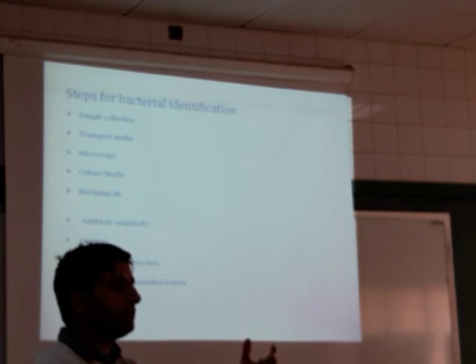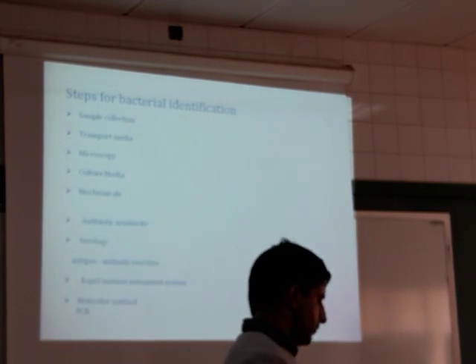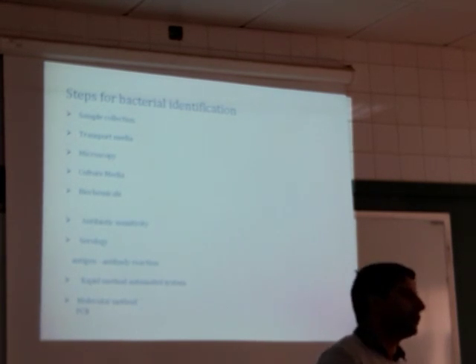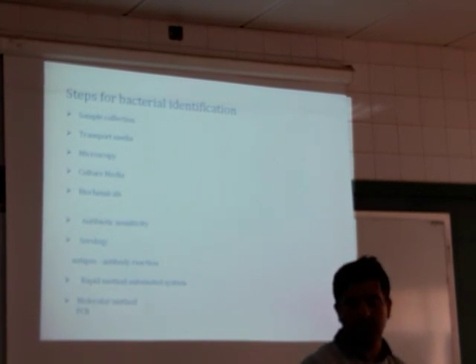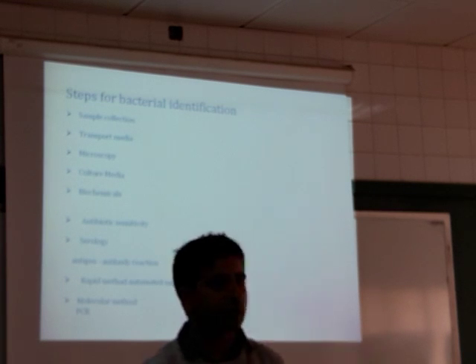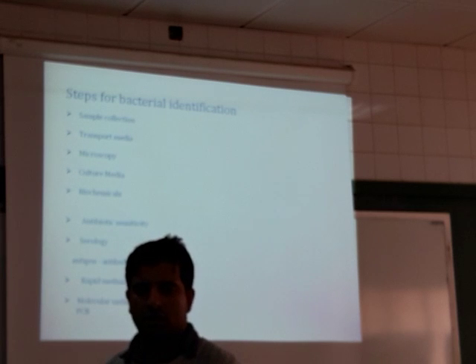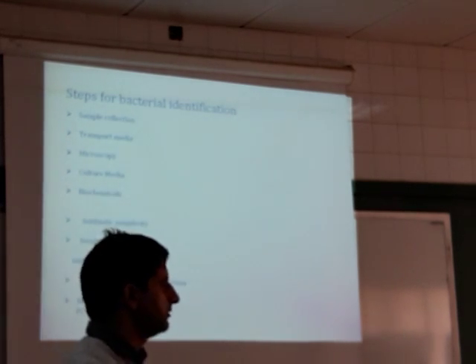And transport. Once you collect the sample from a patient, either from the ward or if he comes to the hospital for the checkup, and the doctor recommends some microbiological tests, at that time when the sample is taken, it should be taken properly to the laboratory. So transport is very important, because some microorganisms die immediately. When they are taken out, they may die within 2-3 minutes, finish. So for that you need a transport media.